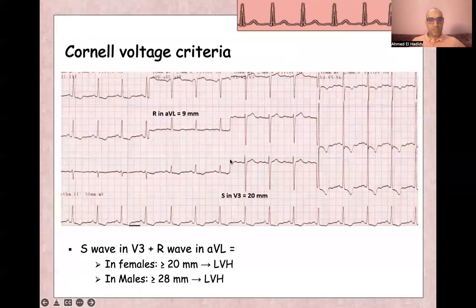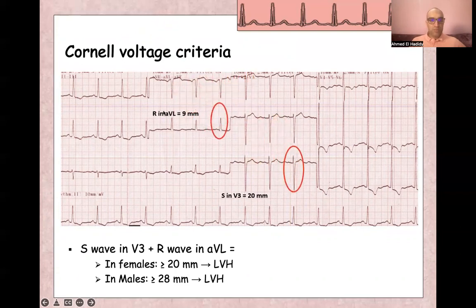There is also the Cornell voltage criteria: S-wave in V3 plus R-wave in aVL should be more than 20 millimeters in females and more than 28 millimeters in males. Counting here, R-wave in aVL is 9 millimeters plus S-wave in V3 is 20 millimeters, which is more than 28 millimeters total.